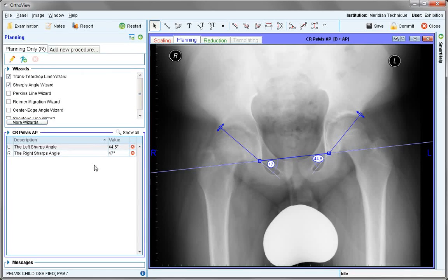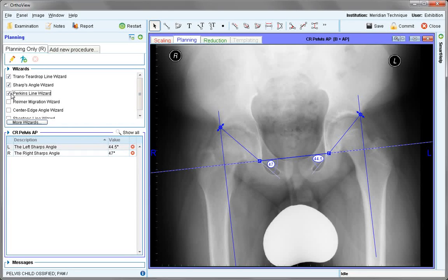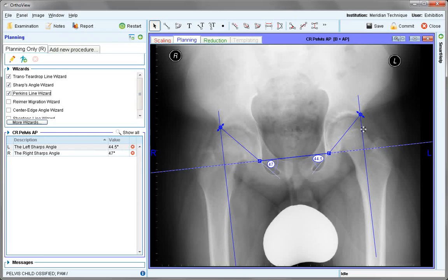Perkins line automatically positions as it uses the lateral part of the acetabulum and also the baseline reference, giving a visual of how much of the femoral head is covered by the acetabulum.